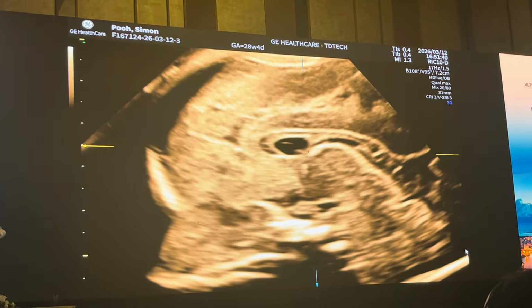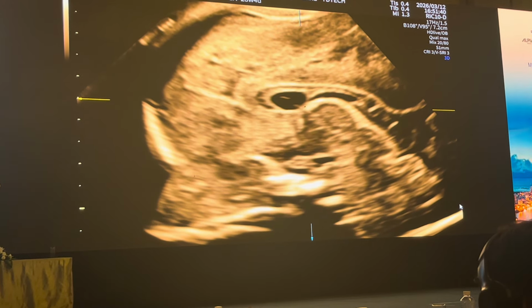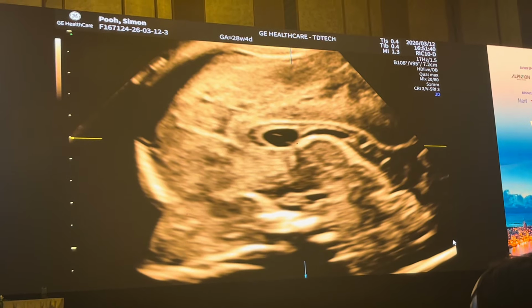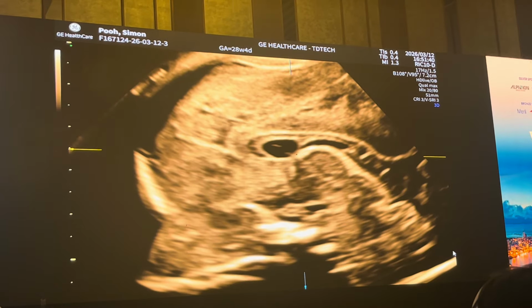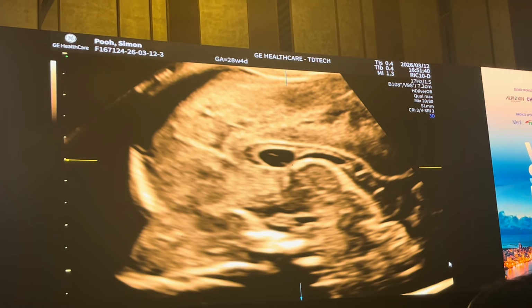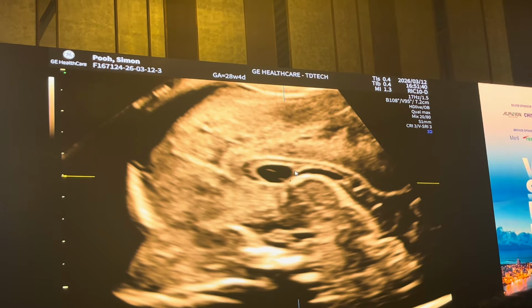And when you look at the corpus callosum, I agree with you that it looks thin. But this is the point that you made with Tsuko. There's not much point in measuring that, right? It's more important that you make a subjective assessment rather than measuring. Can I ask you what you think about the line halfway through, and if you could show us the landmarks of the tela choroidea and why it's important?